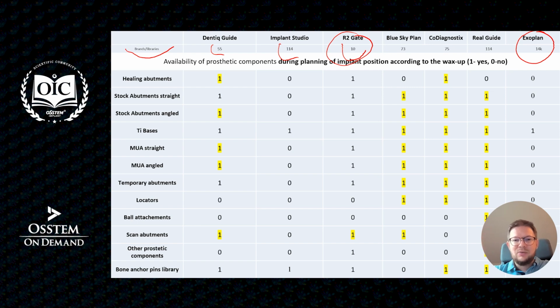However, it's not true, because as I said at the start, I was highlighting that we are talking about clinical softwares, and all of them are clinical. But some information given by the manufacturers is given together with the laboratory extension of that software.